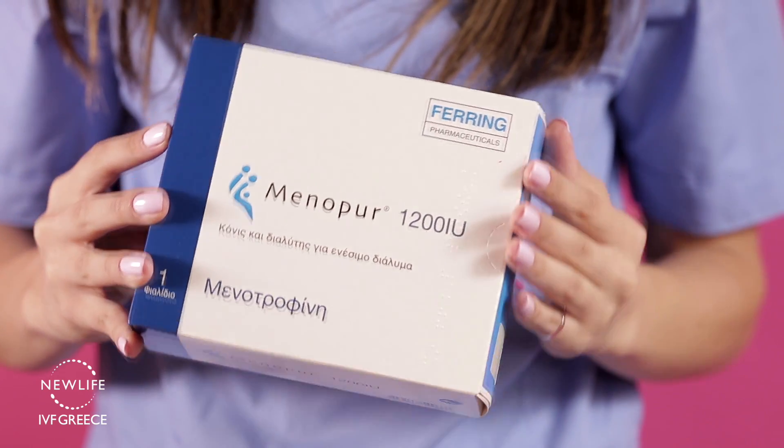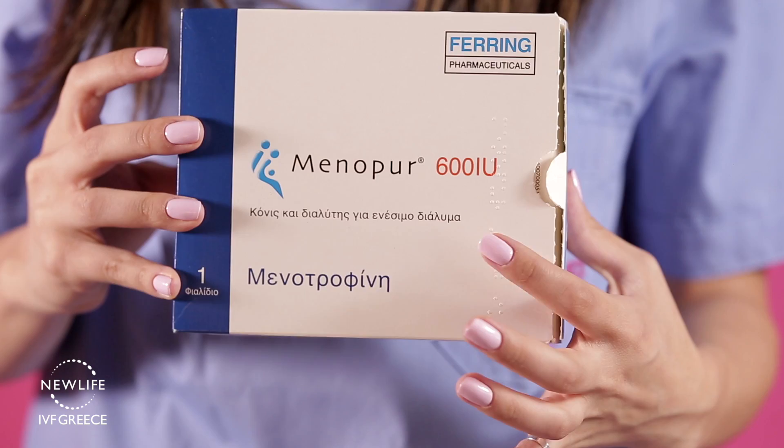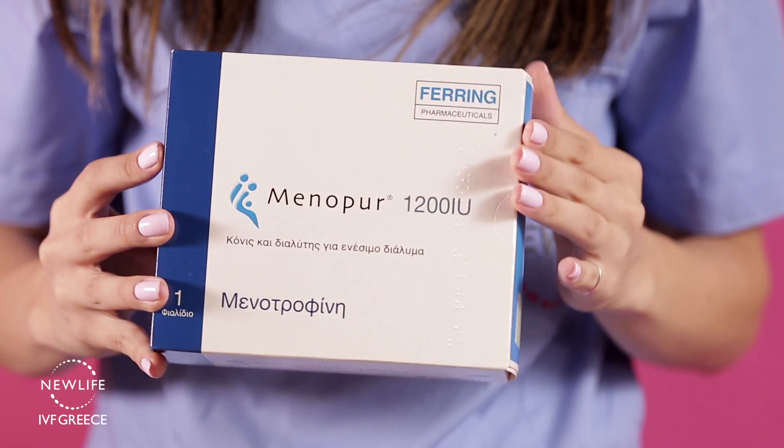Once you receive your medication, store it inside the fridge and not the freezer. Many Menopur injections come in 1200 or 600 unit packages. We will demonstrate today how to use the 1200 unit one.